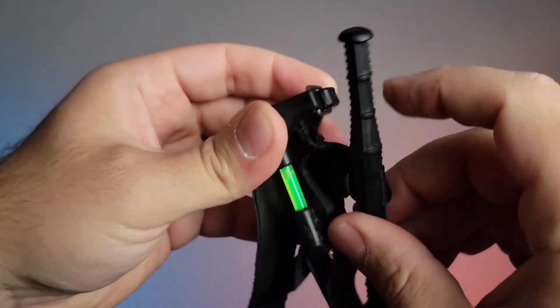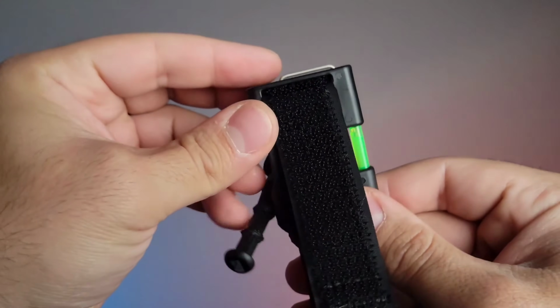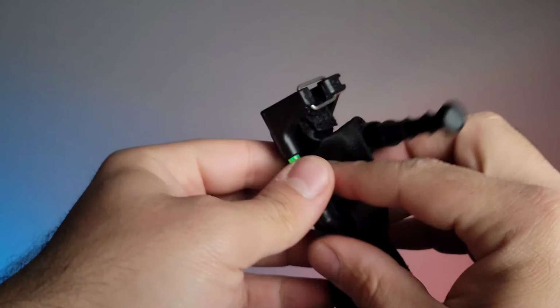Again, if you're in complete darkness, I could see why there's value, but if a person's not able to respond or say like I'm hit or something, maybe they're completely unconscious, I could get why potentially, but it's a very small thing. I'm not saying it's a bad thing to have. They are replaceable. I just find it to have less value. Not saying it's bad, just something to consider.